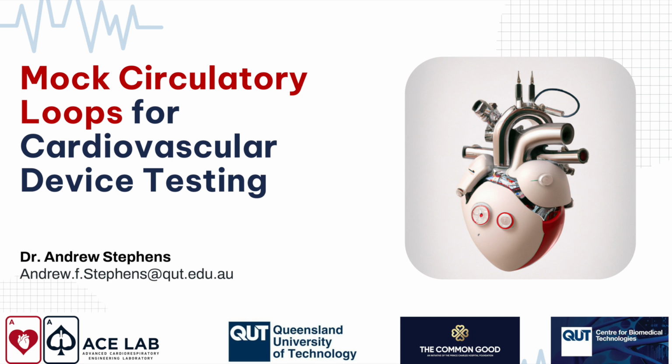So in order of complexity and cost, the dSPACE is probably the industry standard for building onto mock loops. If you've got a spare $27,000 sitting around, this is the one you want to get. The next one down is a National Instruments DAQ.